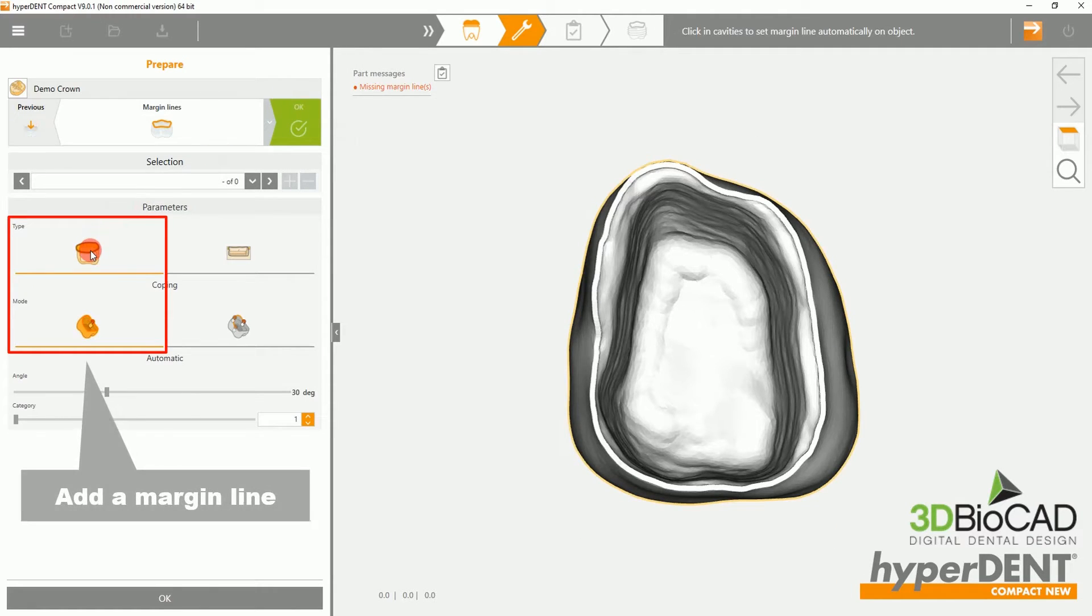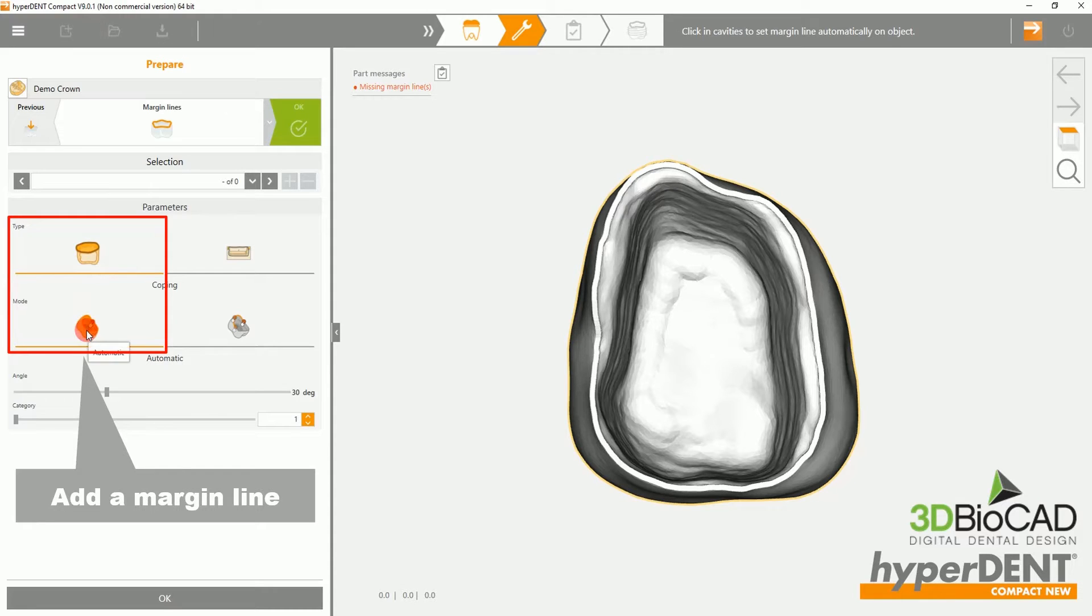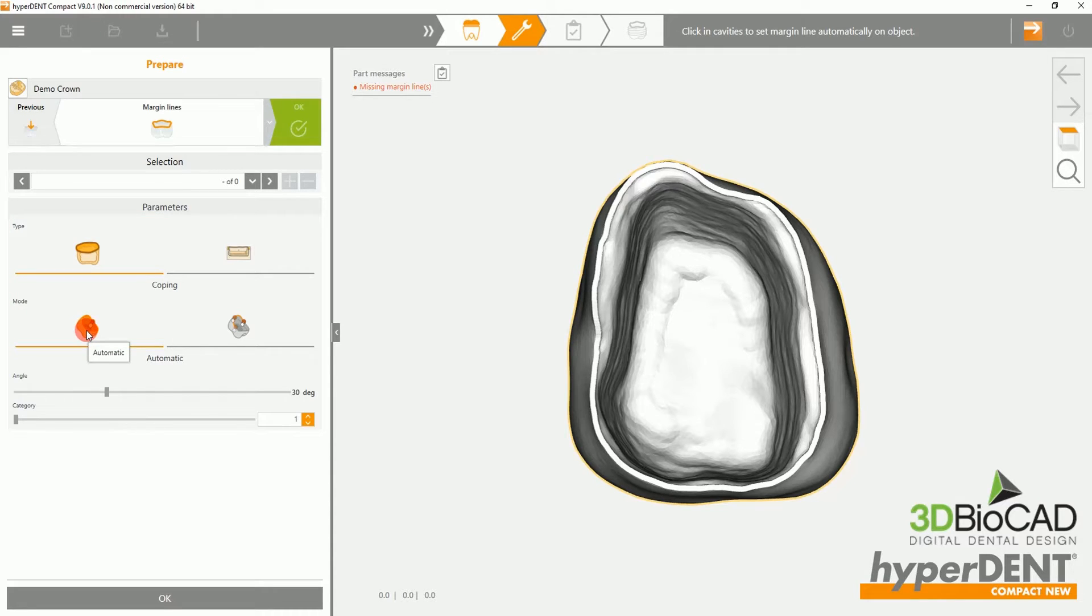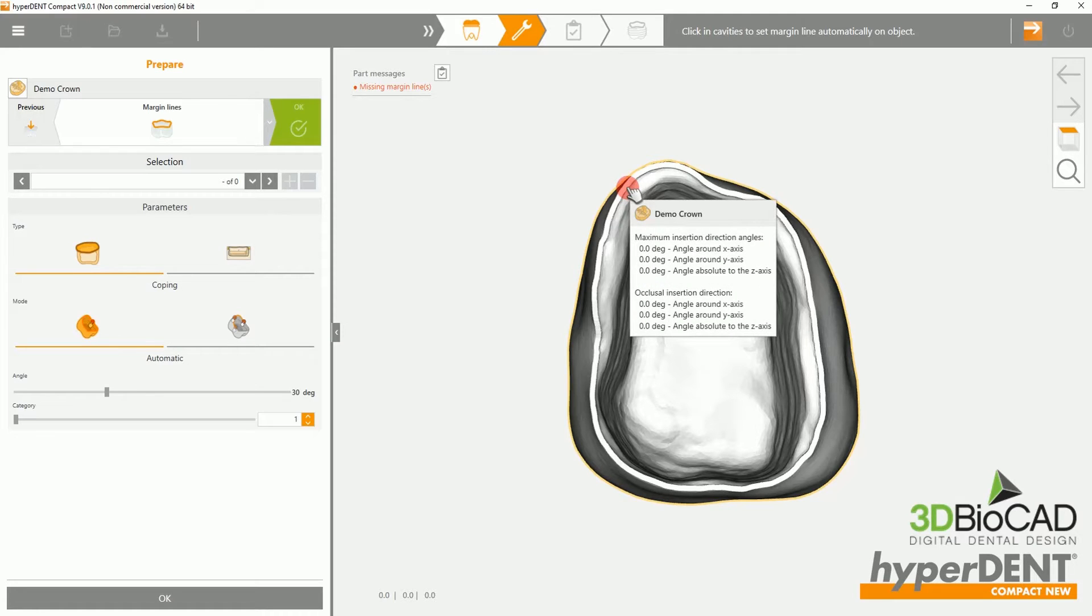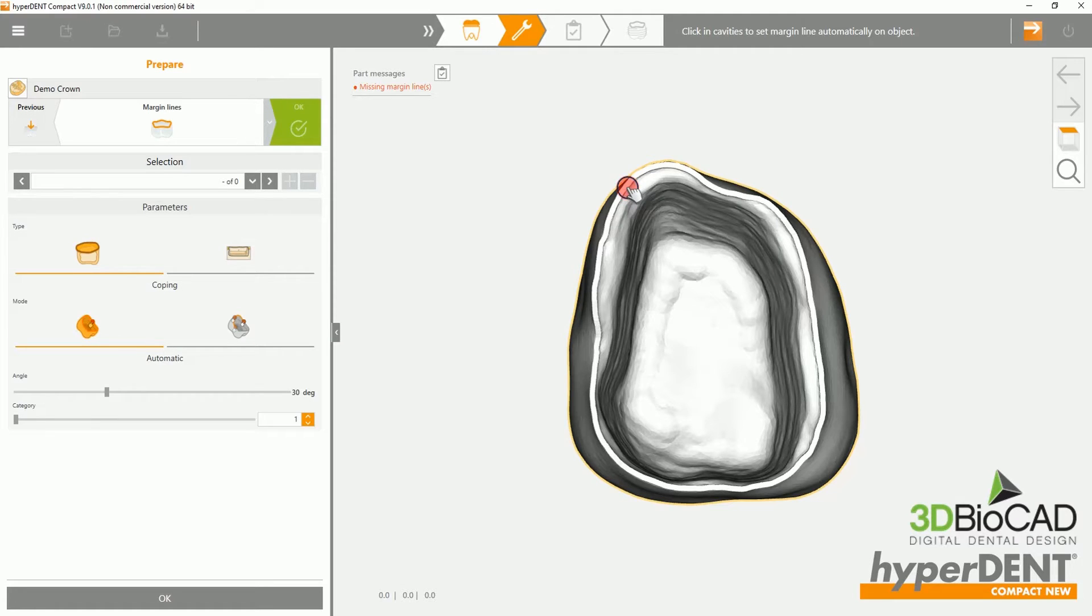To add a margin line, all you have to do is click where the margin line will be. The software will detect and add the margin line for you.